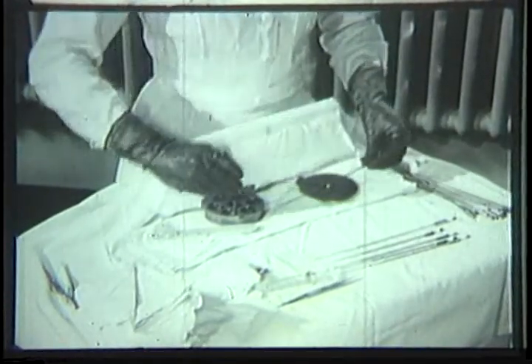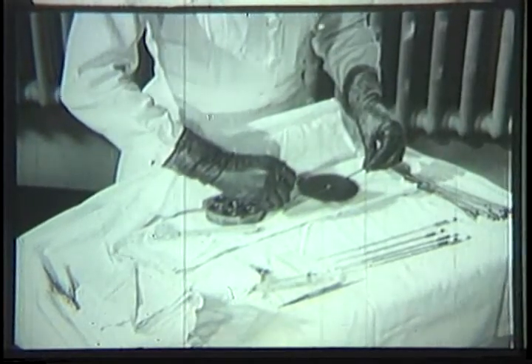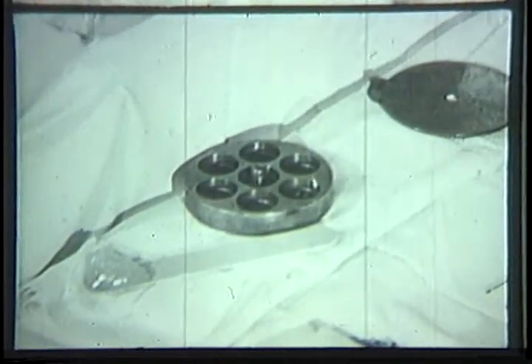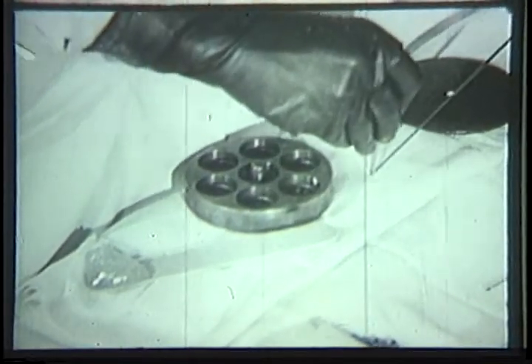Now the seeds are inserted in the tips of the plunger needles. A smear of sterile Vaseline keeps them from slipping out. They're now ready to be implanted in the patient's tongue.